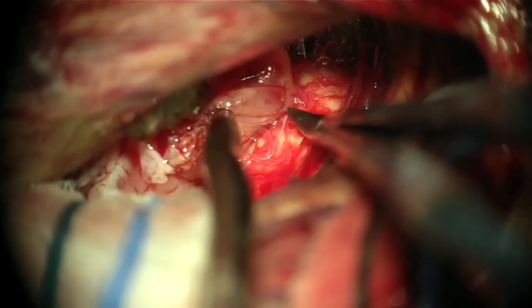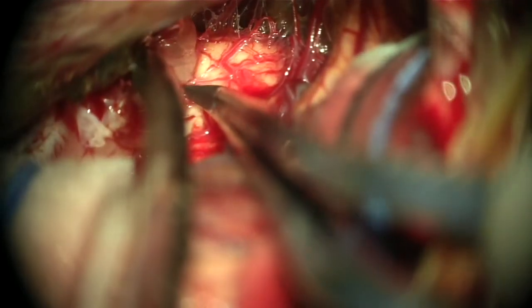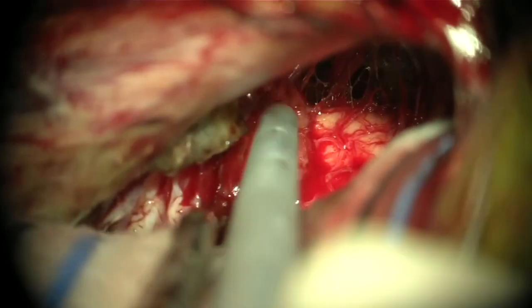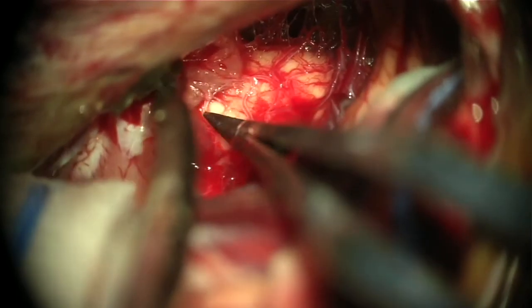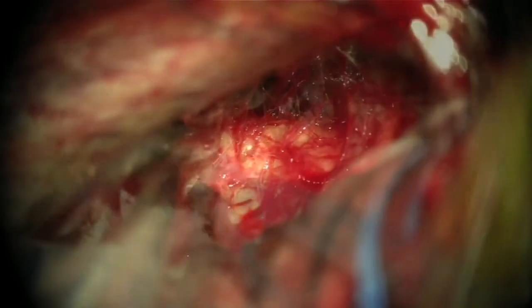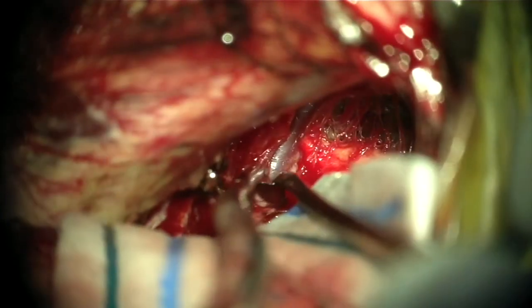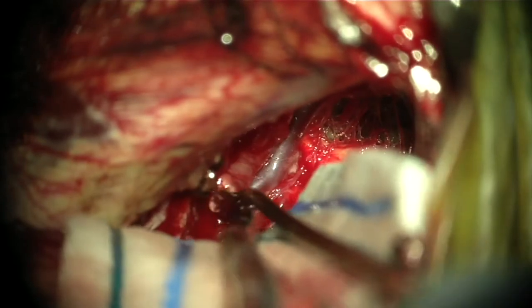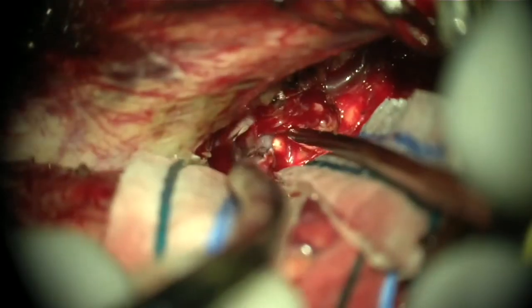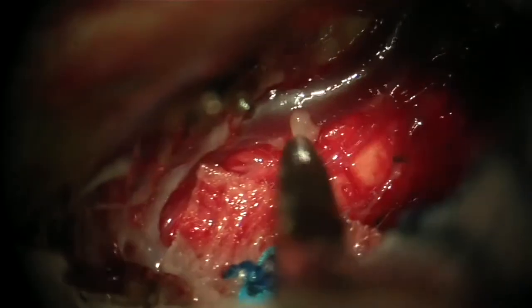Then I debulk the tumor, and I continue dissecting it from all the perforating branches from the quadrigeminal plate and the brainstem. There is an arachnoid and pial plane that separates tumor from brainstem, although there is significant adherence between the tumor and the microvasculature, which made this resection a bit more tedious. But with careful technique we achieved successful resection of this tumor — now we are separated from the basal vein of Rosenthal, now from a PCA branch, that is the calcarine artery as it bifurcates from the P3 trunk.